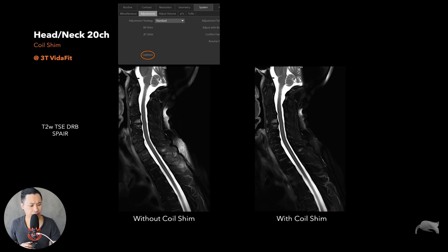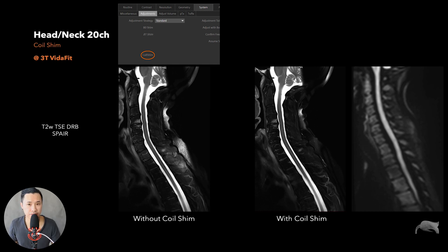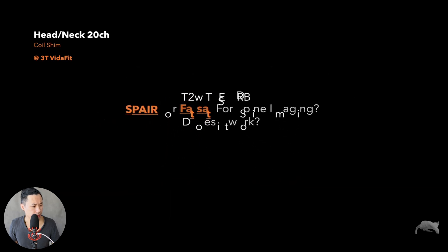With the coil shim it's also very good for diffusion imaging. You can see here with diffusion there are no hot spots from fat suppression failure, no ghosting, because the fat in the posterior region is fully suppressed. You get very good diffusion in the spine and neck area, which is a difficult region.